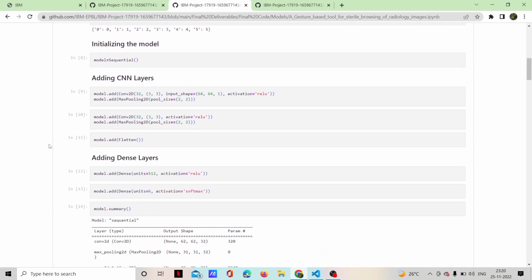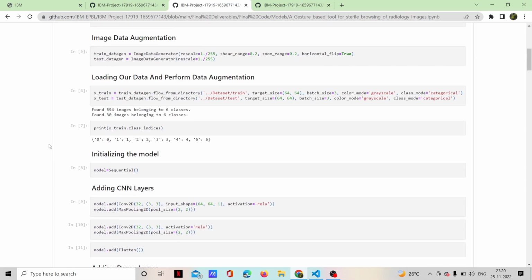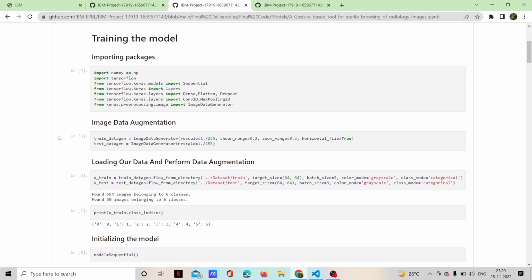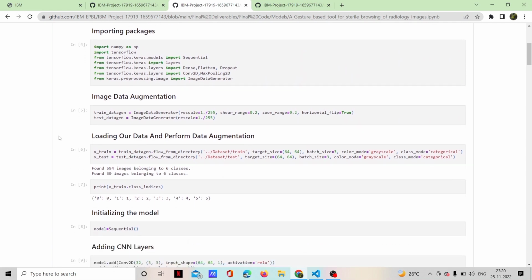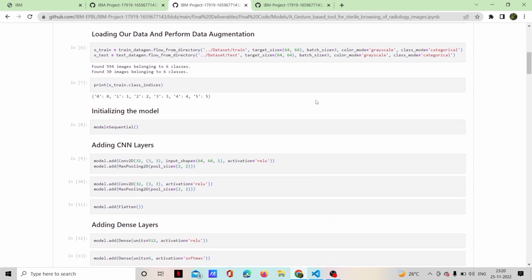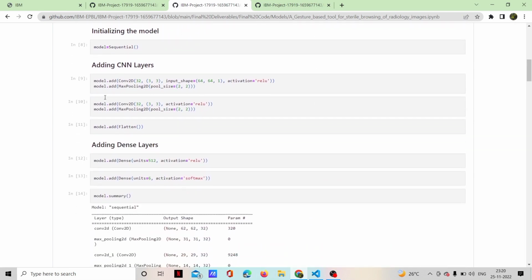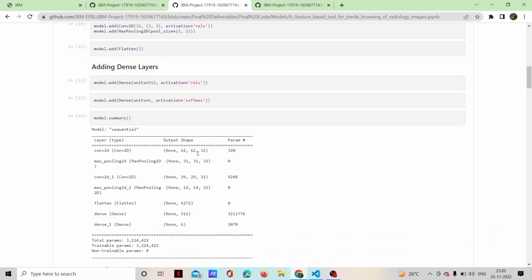Then the next step is building the model. For building our model, we use CNN. We import the necessary packages such as NumPy, Tensorflow, Keras, etc. Then we initialize the model. Next, convolutional neural layers are added, like max pooling, flatten, dense layers, etc. So this is the summary of our model.